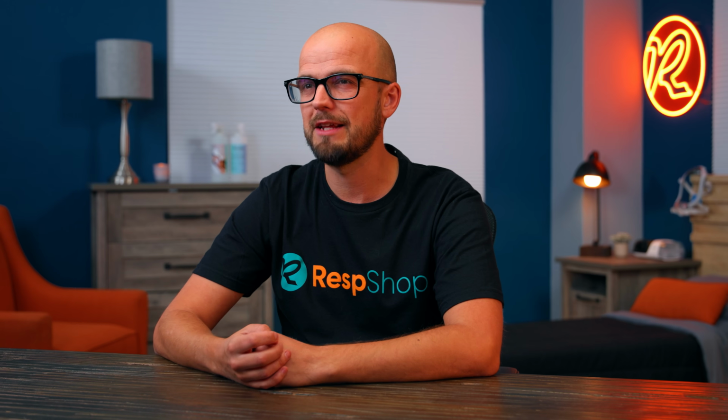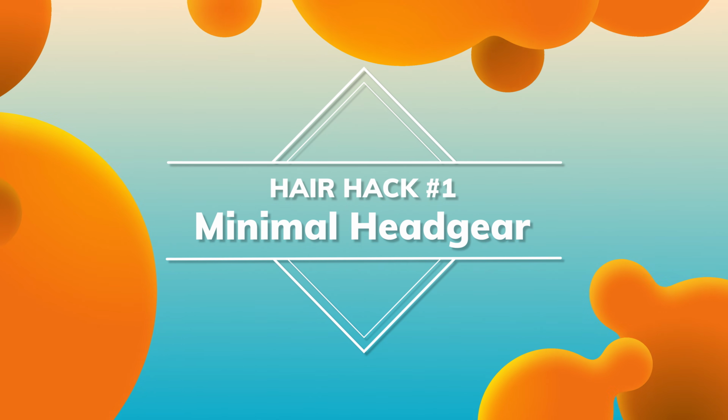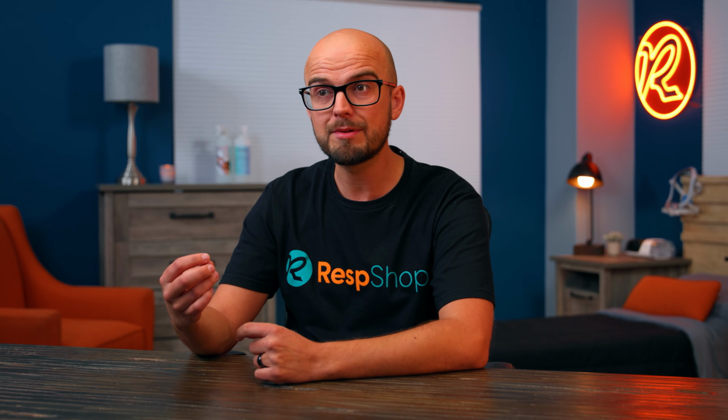But what about those of you with long, thick, or curly hair? The problem here tends to be that straps slip around on your head or tear and damage your hair. So here are some hacks to help you deal with those problems. Hack 1. To minimize hair damage, choose a mask style with minimal headgear. And this isn't just about thinner and fewer straps, it's also about headgear with fewer clips and buckles that press against your hair.